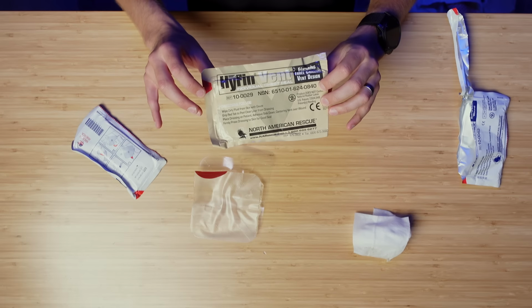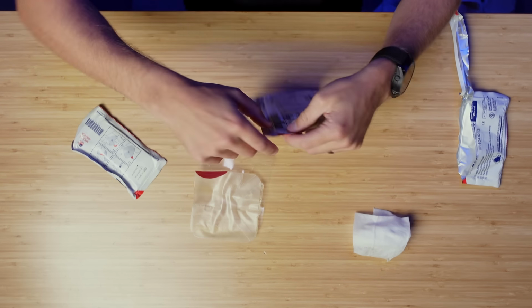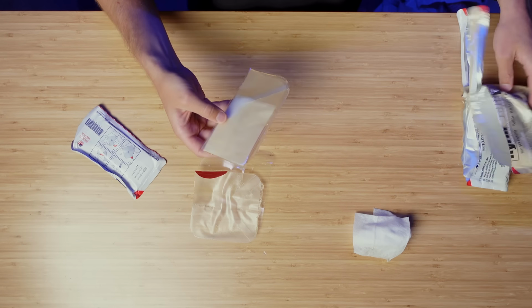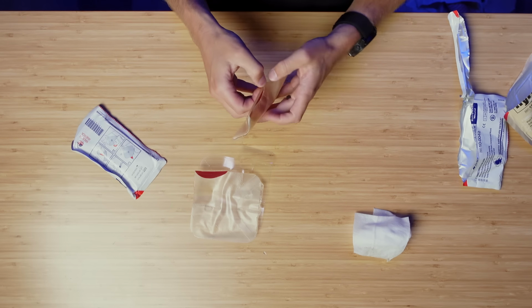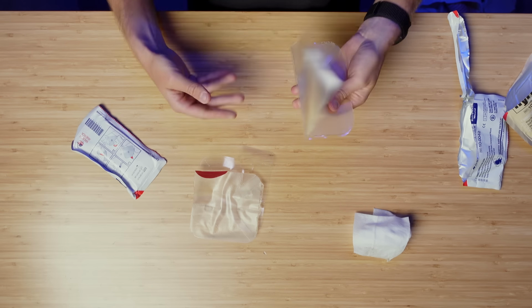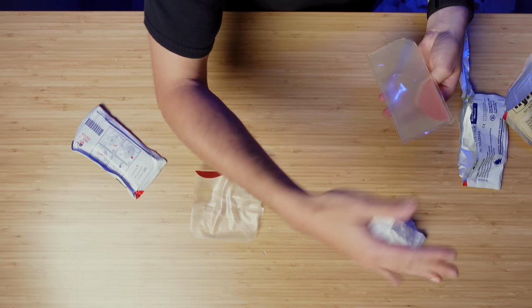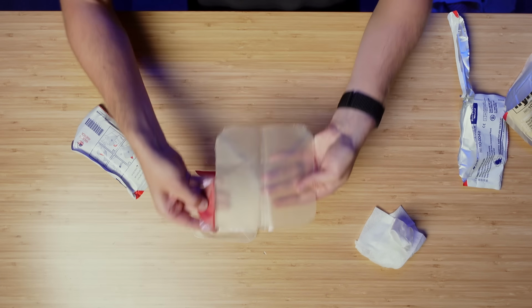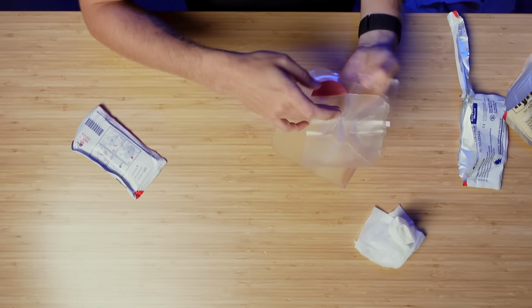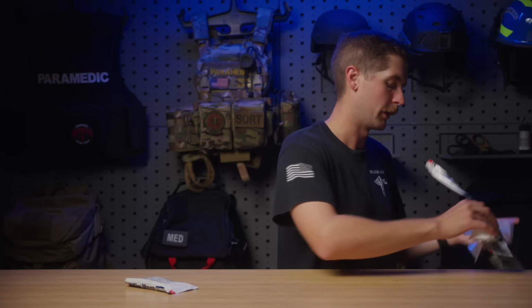Now I'll show you, compared with their individual chest seals, these are like their normal size. It's this, except bigger. While I like these just because of their form factor and the relatively rare situations we use them, these bigger ones are going to be much easier to stick to a patient. It's going to just make it better in all aspects. So you have the same gauze here to wipe things off. I can't even use my hands now. And a much bigger version, but they're the exact same thing. Now, the bigger it is, like I said, the more surface area can stick on their chest, the more effective they're going to be in the long run.